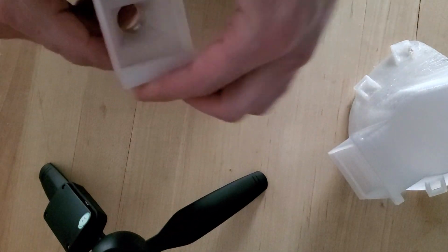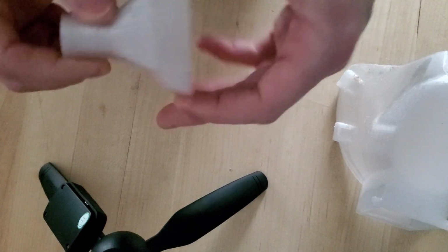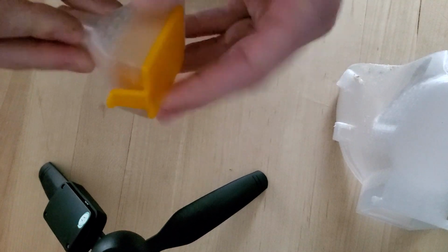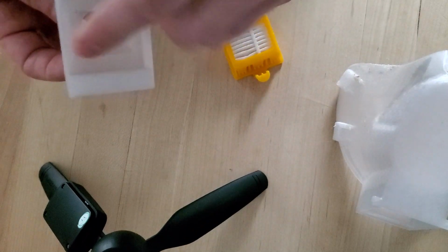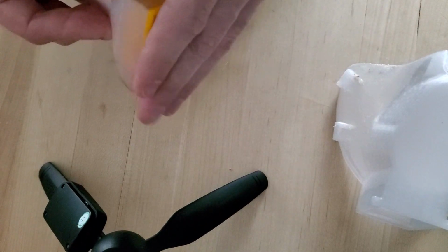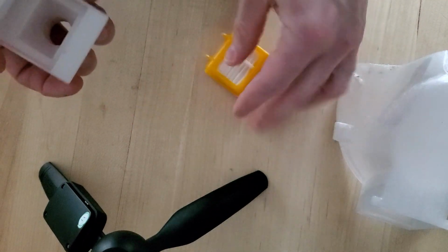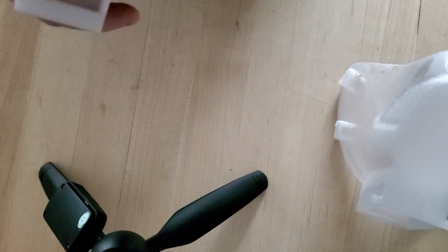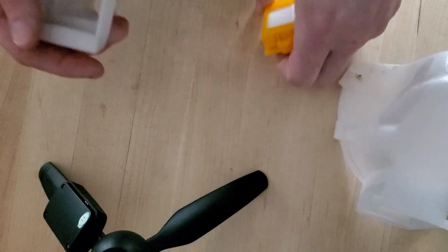Okay, so what we're gonna do here is we've got two different systems, but I'm gonna show you just on this one. This is basically a one-off filter, meaning you could attach it to any mask. So it locks on here, but we want it to create a seal. And rather than trying to work up top, getting this to seal, I'm actually gonna try to seal on the inside here to there. There's a slight gap of around 1 millimeter there, and so that's what we're gonna work with.